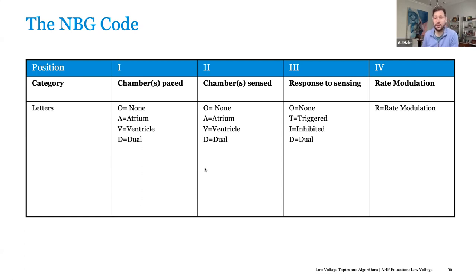We can program a dual chamber device to act like a single chamber device. We cannot program a single chamber device to act like a dual. I know that makes sense, but I felt like I should cover it.